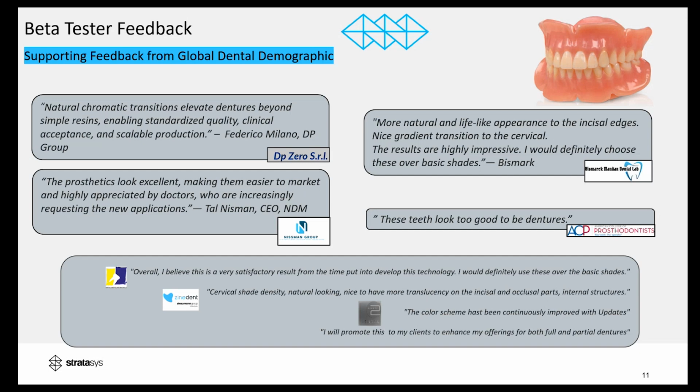And we do have another question about the teeth being separate. Yes, they need to be a separate STL file for the software to be able to identify which teeth are which. So if they're together in a single STL, it won't be possible to utilize TrueVoxel.